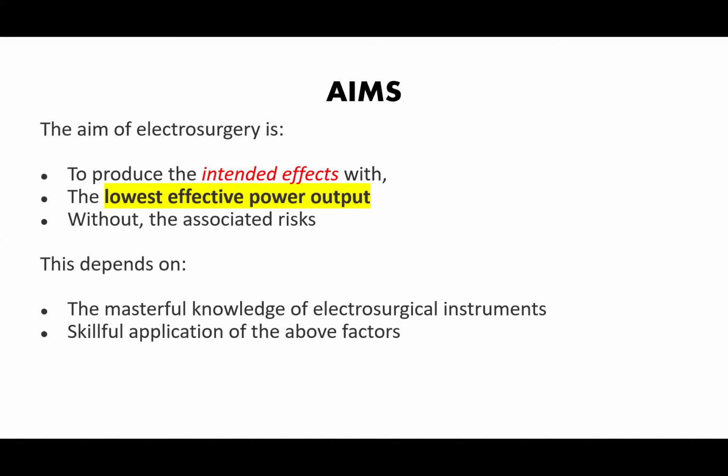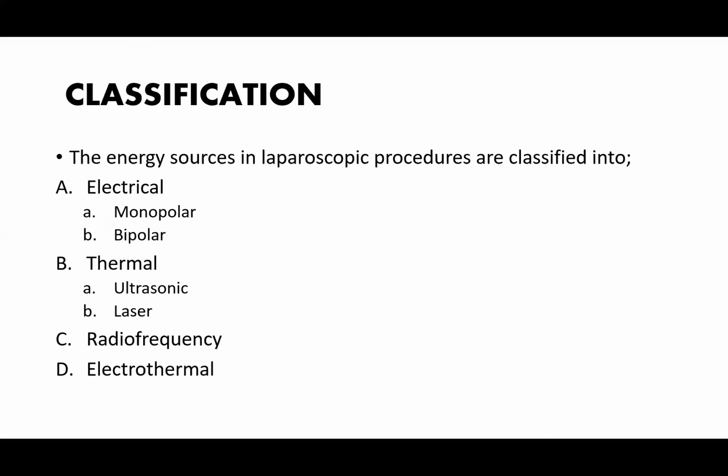Now, this depends on the masterful knowledge of electrosurgical instruments and skillful application of the above factors. So it's very important. Now, how do we classify the energy sources or the energy devices used in laparoscopic procedure? The classification usually is into electrical sources, thermal sources, radio frequency sources, and electrothermal sources. Now, you may come across various classifications, but this is a broad classification, and we will talk about some, not all, of the energy sources here.